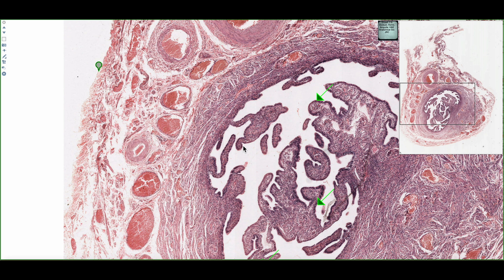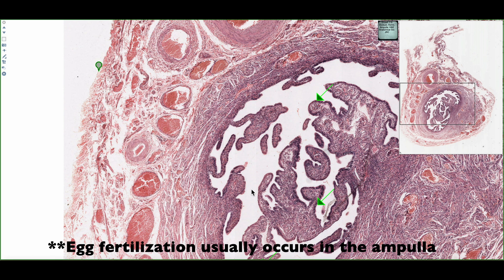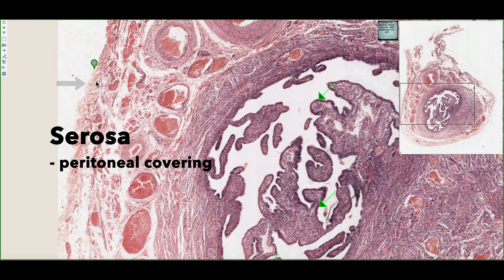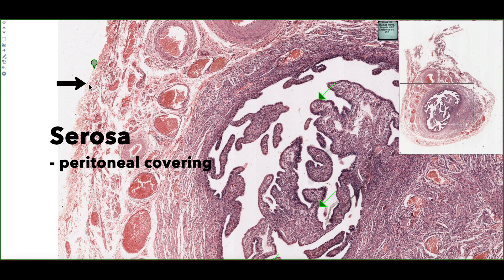In this tissue section, we can see the ampulla region of the oviduct. The ampulla region is closer to the ovary than it is to the uterus. On the left-hand side of the screen, we can see a layer of simple squamous epithelium. This is called the serosa, and is essentially the peritoneum that forms the broad ligament.